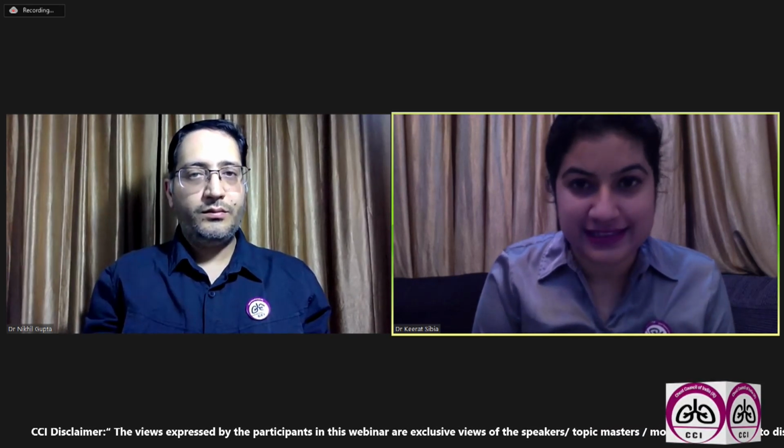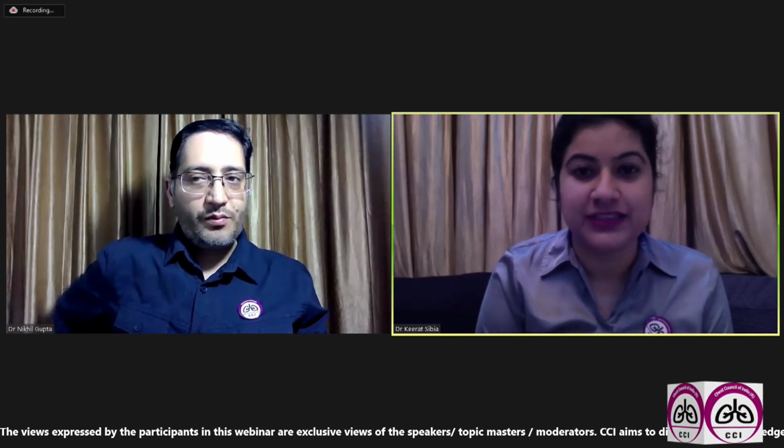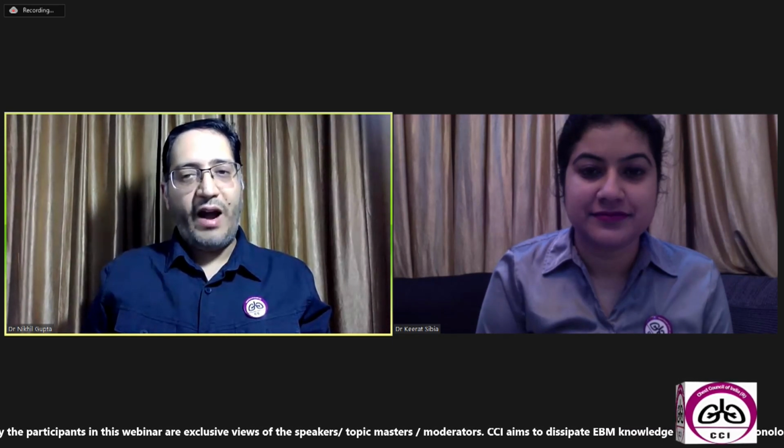This is what we commonly come across as the silhouette sign, very commonly seen when we use the terms paracardiac density or homogeneous opacity. Let me ask you, are there any conditions where the finding on chest X-ray looks like the silhouette sign but is not actually the silhouette sign? What are the mimics of silhouette sign on chest X-ray?